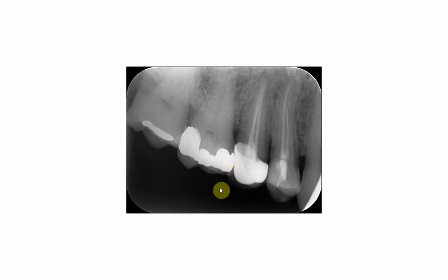This is expected because the thickness of the material used in the core is less than that of amalgam, and of course amalgam is a denser material because of its components, so it will appear more radio-opaque. If we look at the root of the tooth, we will see that it is filled with gutta-percha, which has the least radio-opacity of all these materials because of its components.